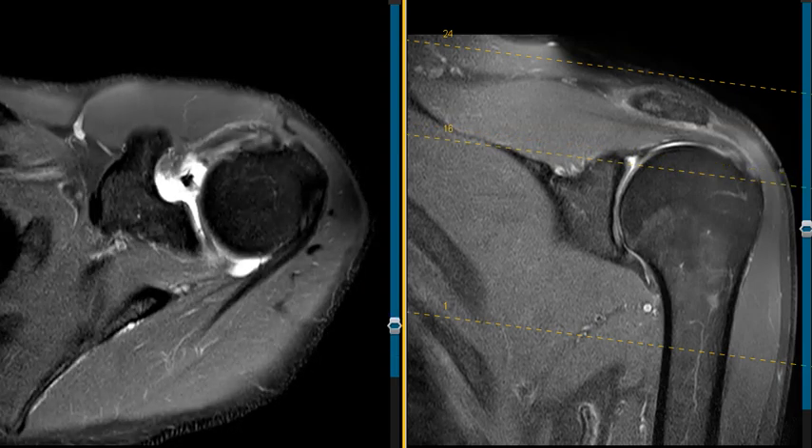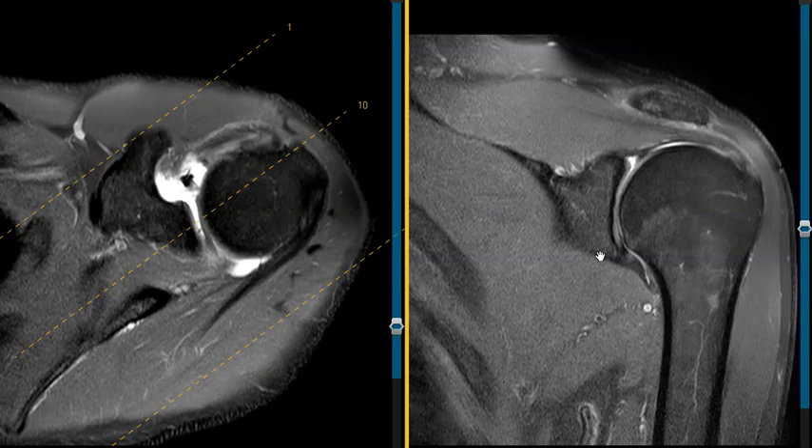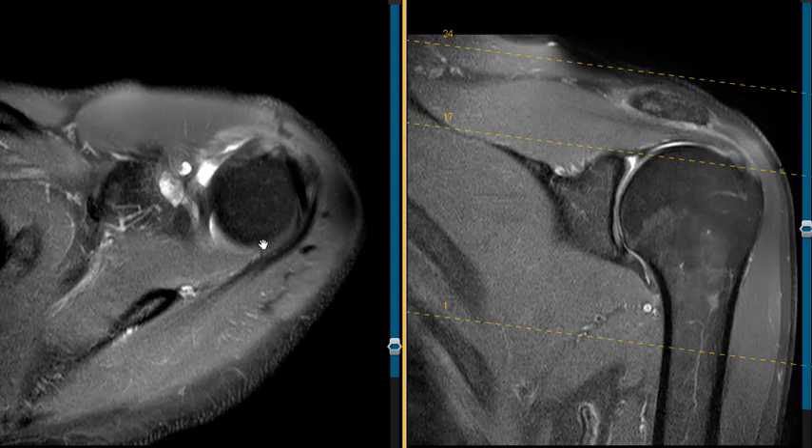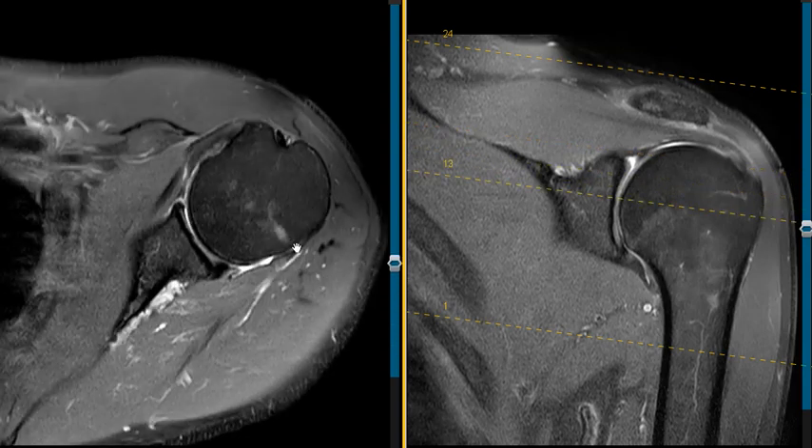As we go up to the top we see this bright band — this is the fluid going between the torn labrum and the periosteum of the glenoid. So a superior labral tear from anterior to posterior, a SLAP tear, in this 52-year-old man. Thank you very much.